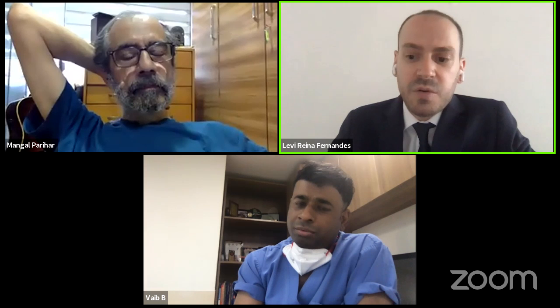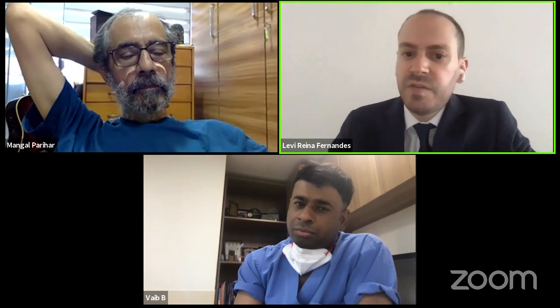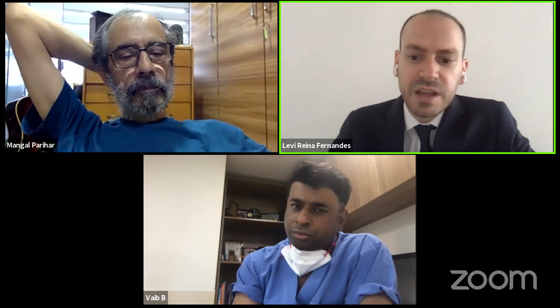In the last ones that we did, where we forget the rod, we are actually getting good results, 1%, 2%, 3% of difference. There are some that I planned for colleagues of mine, and I don't have the feedback of the full result. But if you ignore the rod, the range that we get is really close to what we plan.